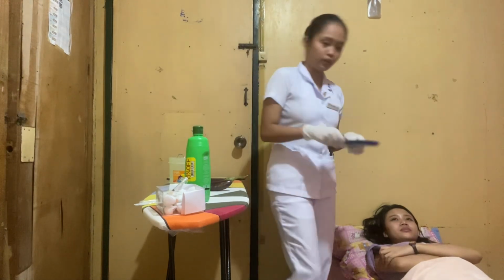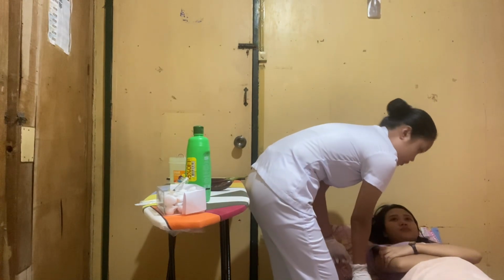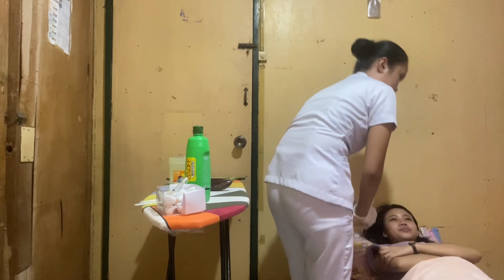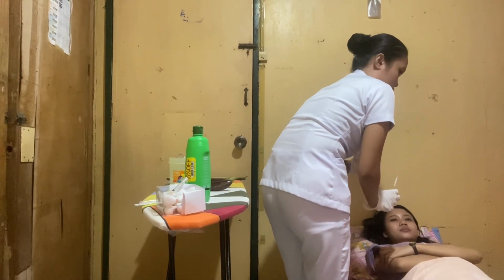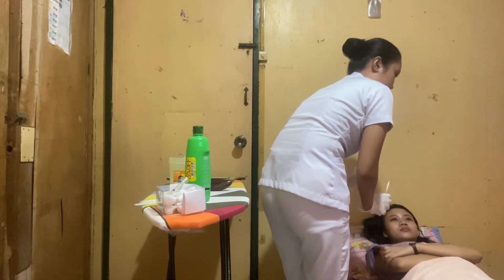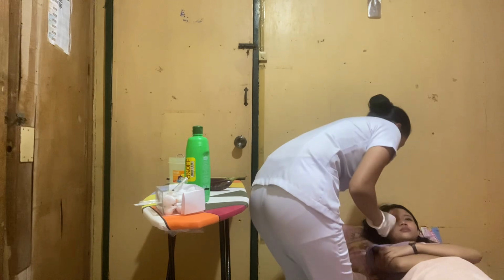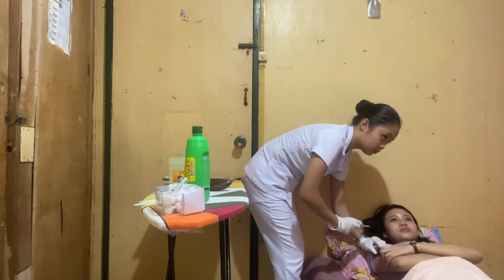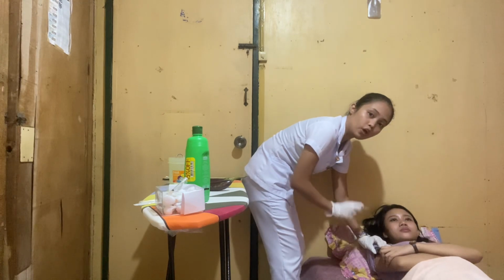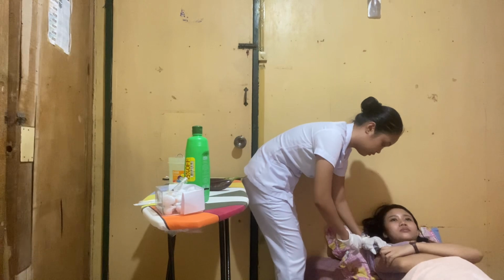So we're going to get our syringe and uncap the syringe and hold the syringe using the dominant hand and use the Z-track method, and we'll advance the needle into the patient's skin. So we're going to advance the needle at a 90-degree angle.